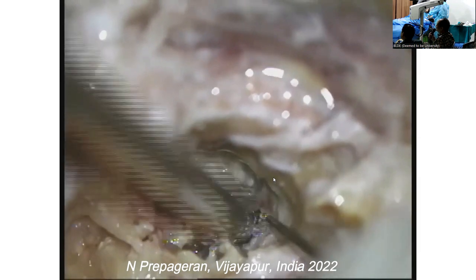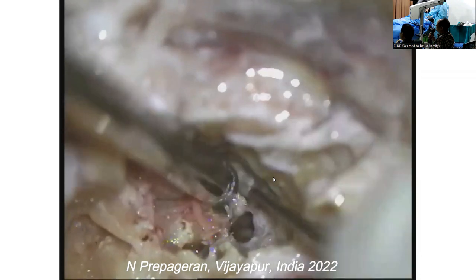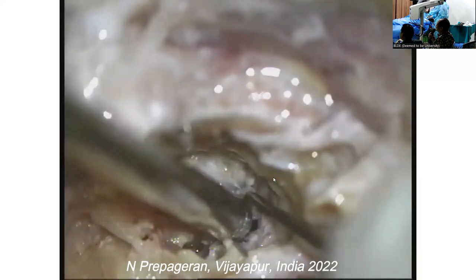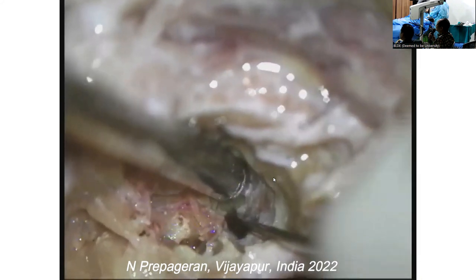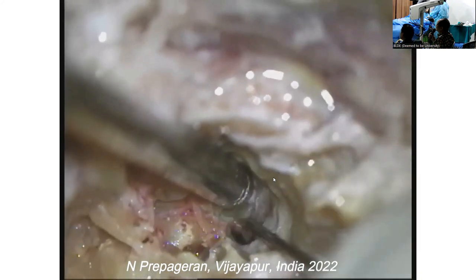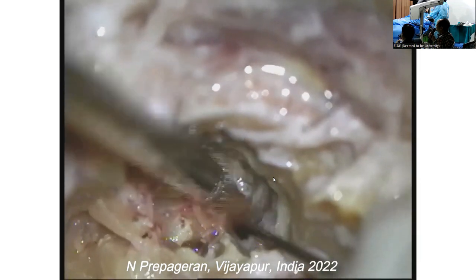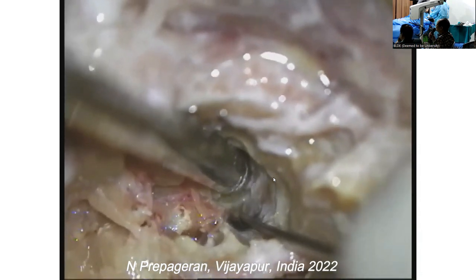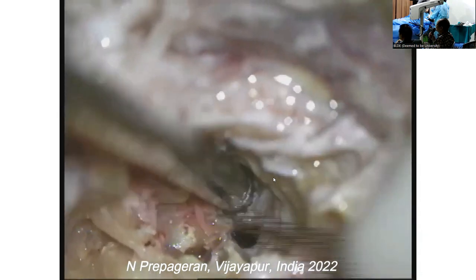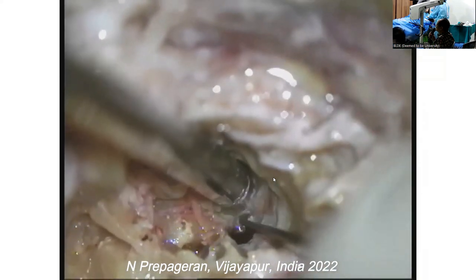Once you open the jugular bulb, you can actually dissect from the jugular wall, and your nerves will be in front and medial. Can you see? So I'm going to dissect this. Can you see the space I'm dissecting?